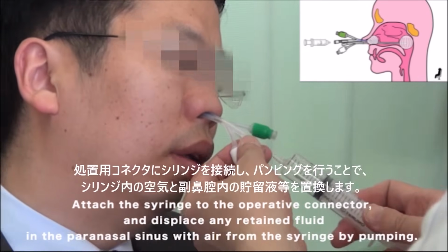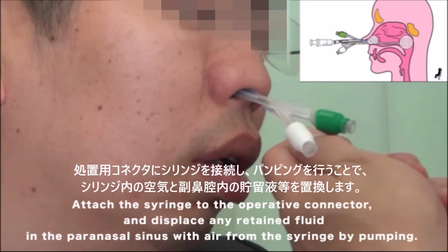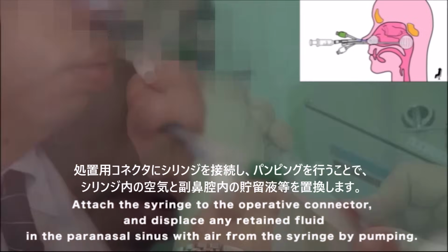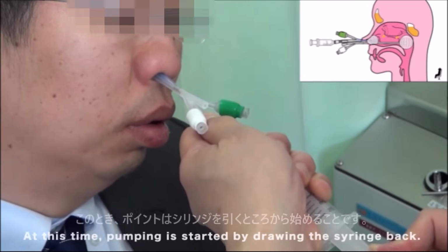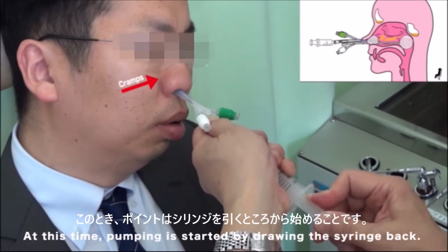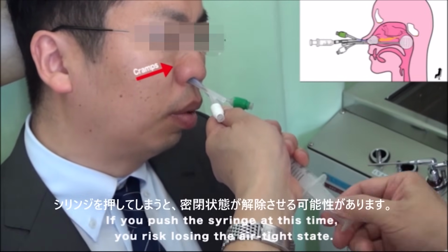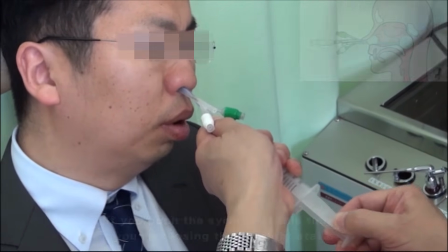Attach the syringe to the operative connector and displace any retained fluid in the paranasal sinus with air from the syringe by pumping. At this time, pumping is started by drawing the syringe back. If you push the syringe at this time, you risk losing the airtight state.